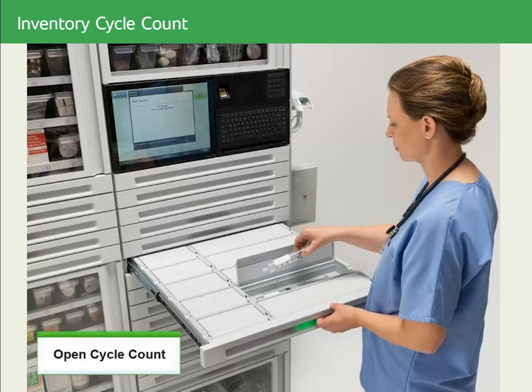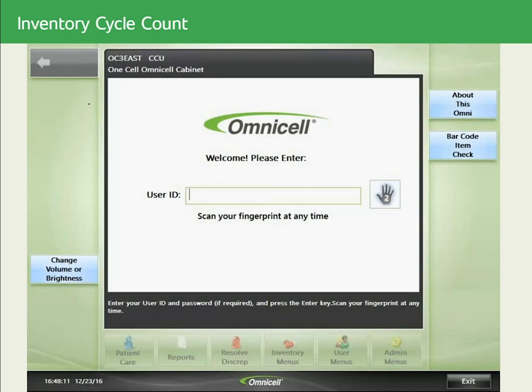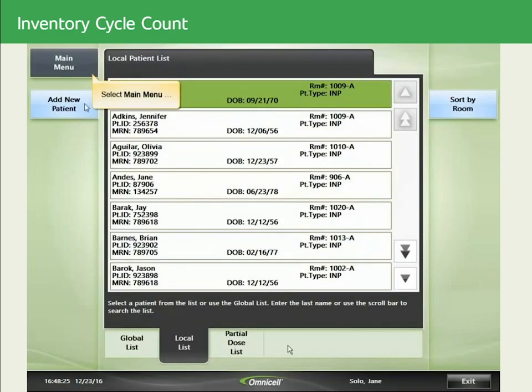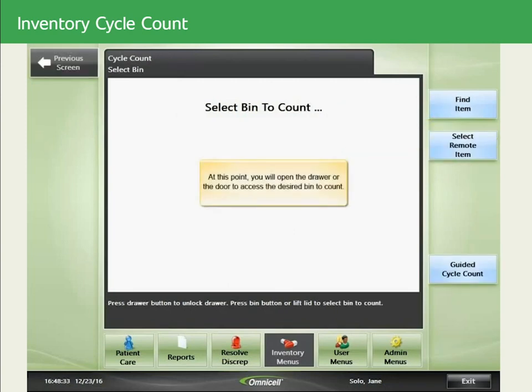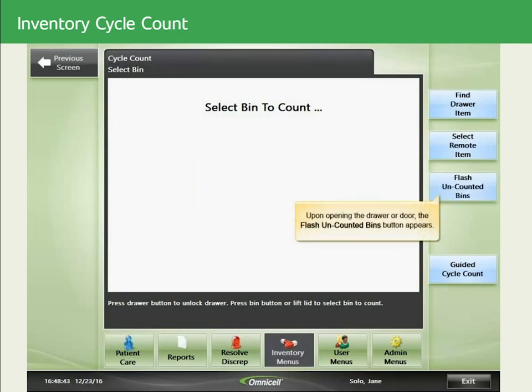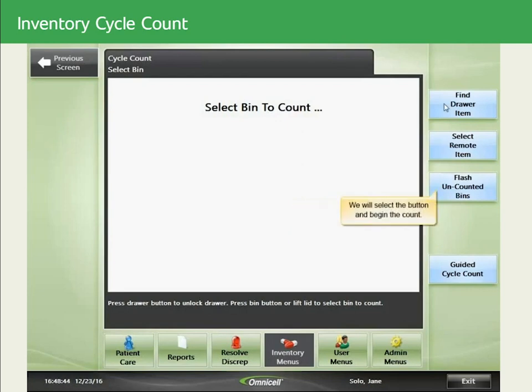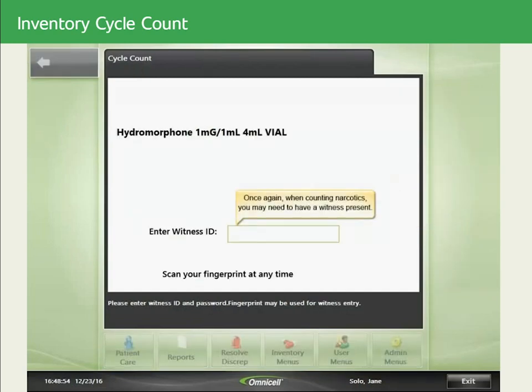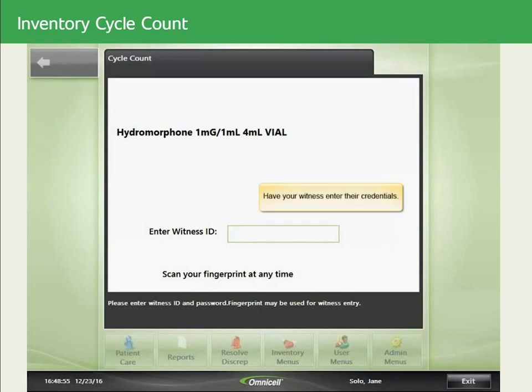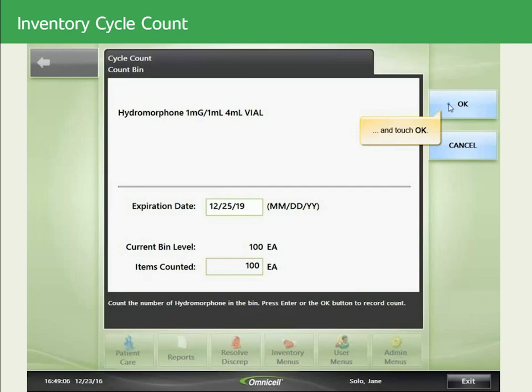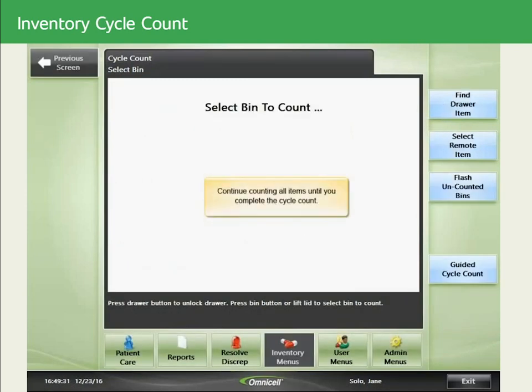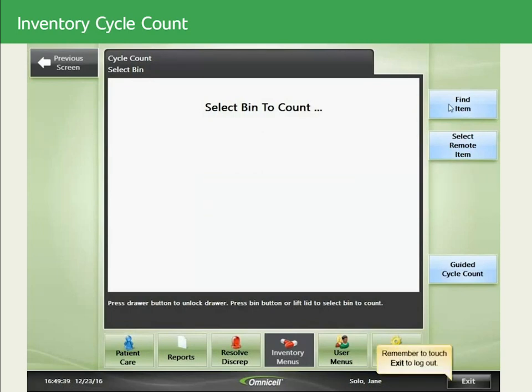For an Open Cycle Count, log on to the cabinet and navigate to Main Menu, Inventory Menus, Cycle Count. Open the drawer or door to access the desired bin to count. Upon opening, the Flash Uncounted Bins button appears — select it to begin the count. When counting narcotics, you may need a witness; have your witness enter their credentials. Enter the count and touch OK. Continue counting items until the count is complete. When done, remember to touch Exit to log out.